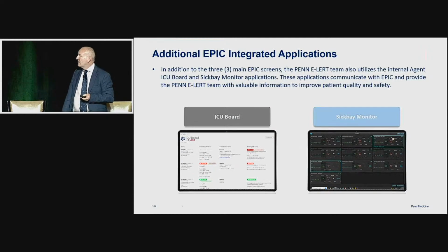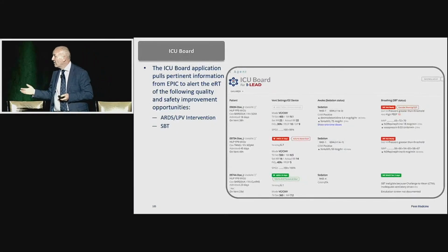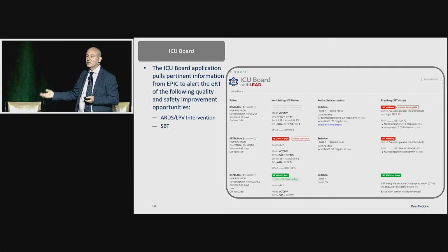We've got other integrated applications to achieve this. We have something called an ICU board, which one of our pulmonary critical care attendings, Barry Fuchs, has built. It's a very good thing that we ran with in the morning on all the units. And it's basically a nudge board, just to make sure of what's happening with the patient, everything from ventilation, SBTs, have they got low stretch ventilation ordered, and other things about mobility.